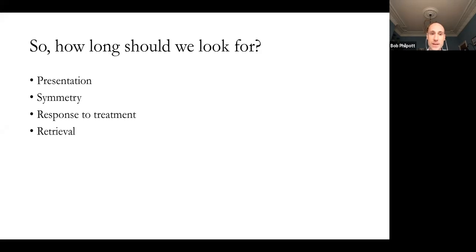So if, for example, the patient did come in like that image I showed you of the upper six, and they had a failed root canal treatment, periapical lesion on the mesiobuccal root, and what looked like a single canal filled, I would think, hang on, could be an MB2. I look at the symmetry in lower teeth for missed canals. So if I've got 3 canals in a lower molar and I'm saying this looks asymmetrical, and sometimes that voice in your shoulder is saying to you, just fill it, you've done so much work, it's so clean, this will have no effect on outcome. If it looks asymmetrical, there's probably a canal there, so you need to look for it.